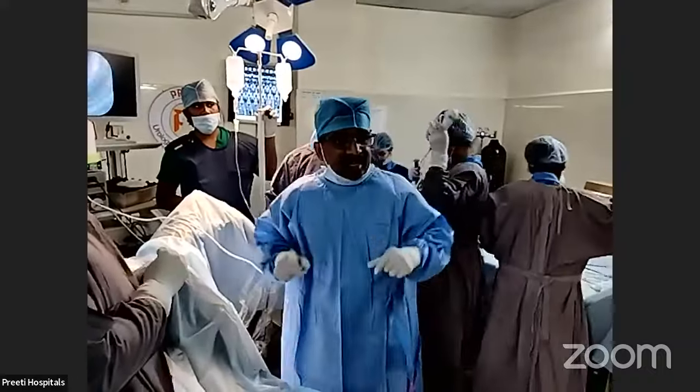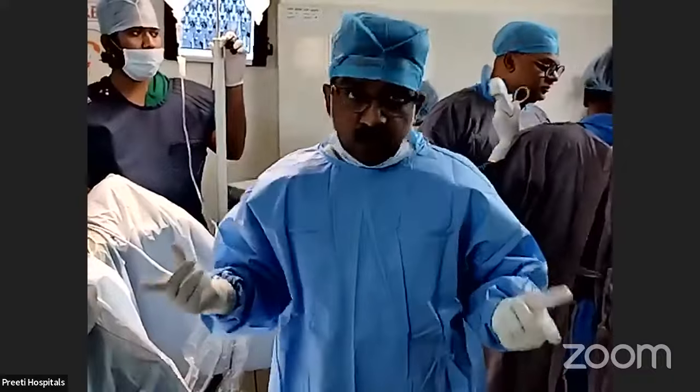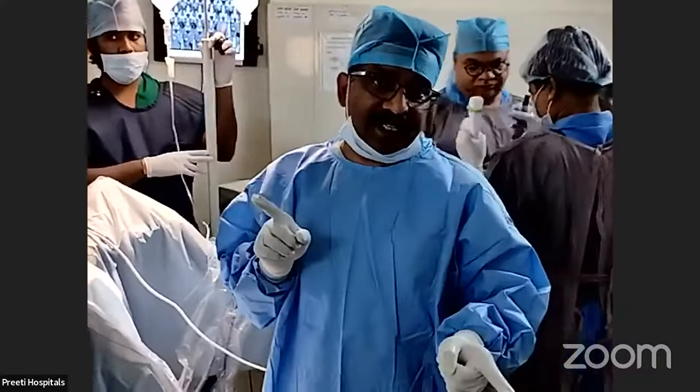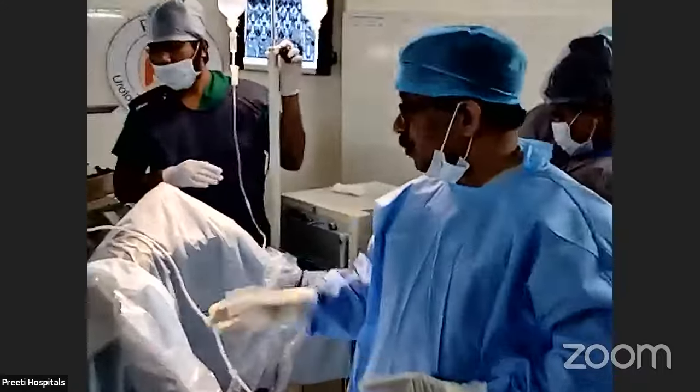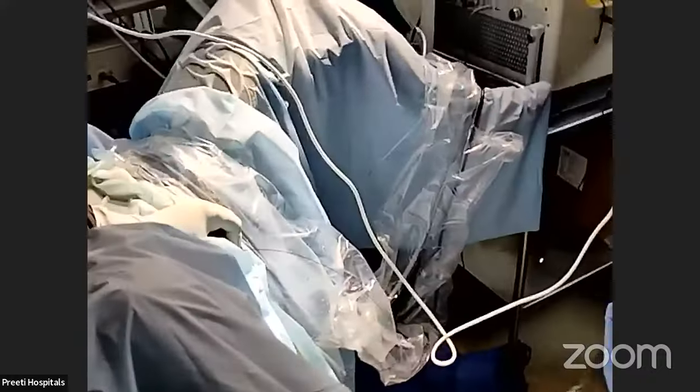So only one problem I had here. The access sheath was not going easily, even in a post-stented case. In that case, stop the procedure and do PCNL, because one more time you should not try. So you should be well versed with PCNL as well as RIRS. So to conclude, now I will put the Foley's catheter. And then we will see.